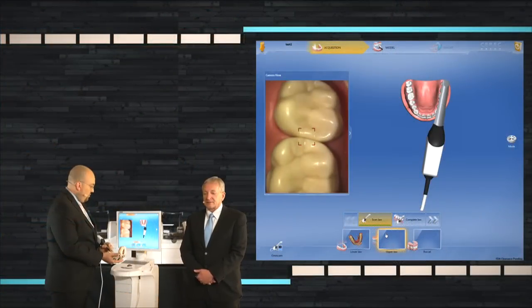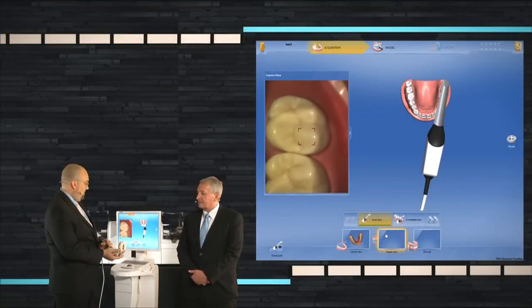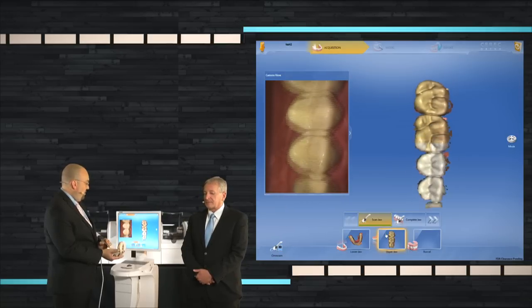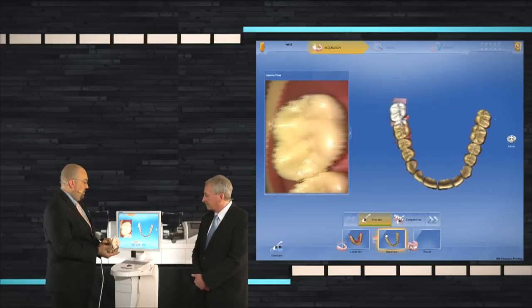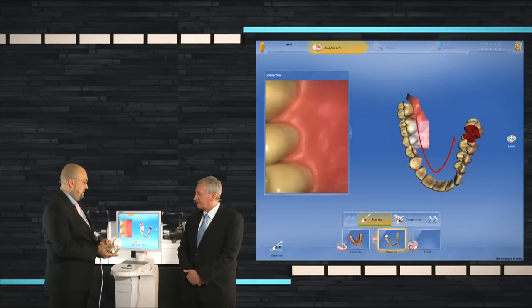Sure. First of all, I'm just going to jump right into the scanning process here. First, you should hear some audible cues. And of course, on live TV, you always have some minor hiccups. But you'll have the audible cue that gets you started here. And what I'm going to do is an occlusal sweep around to the end of this arch. And at the end, you're going to hear a couple of other clicks. And this is going to begin that guided scanning technique.